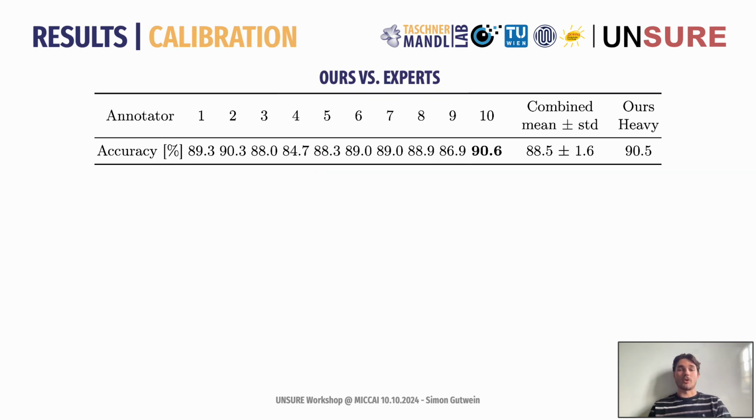We compared the model's classification accuracy on a synthetic test set with the performance of 10 independent human experts. Our model matched the best annotator and outperformed the average expert by 2%.